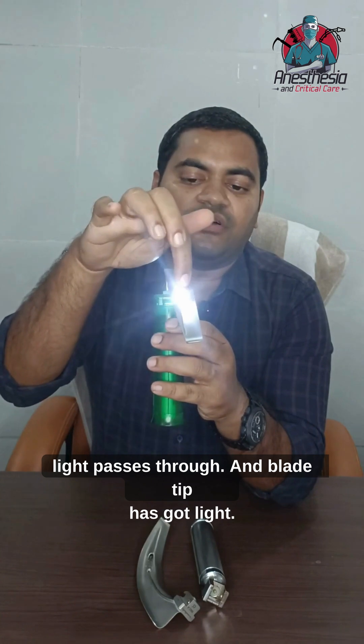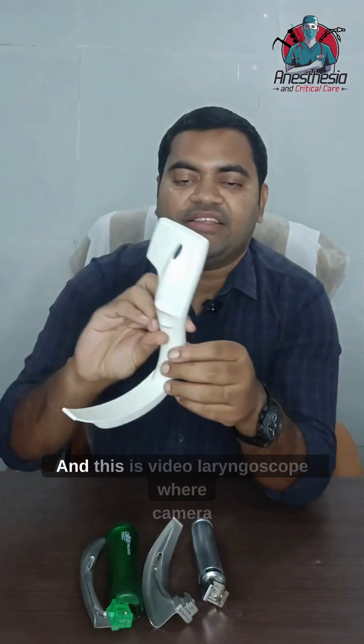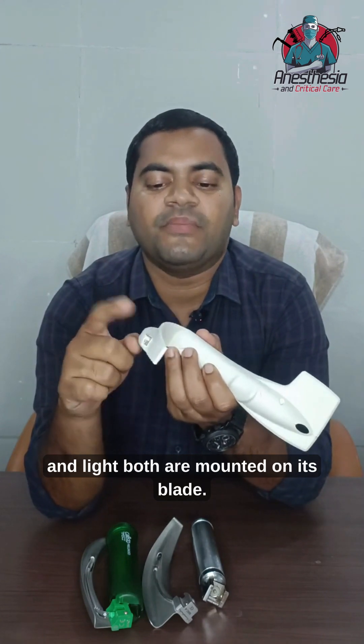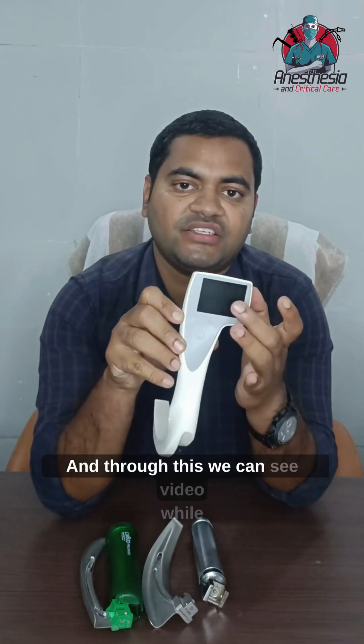This has a power source inside the handle and a transparent channel through which light passes. The blade tip has a light, and this is a video laryngoscope where both a camera and light are mounted on the blade, allowing us to view video while intubating the patient.